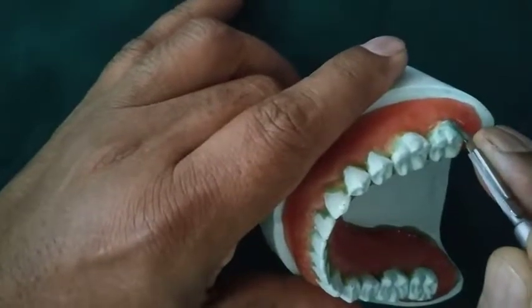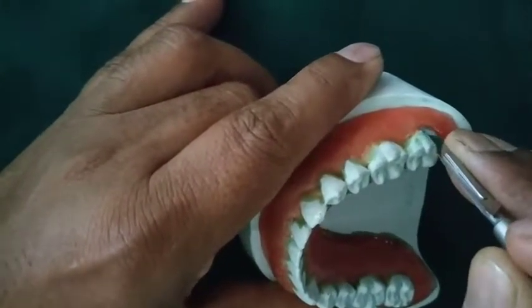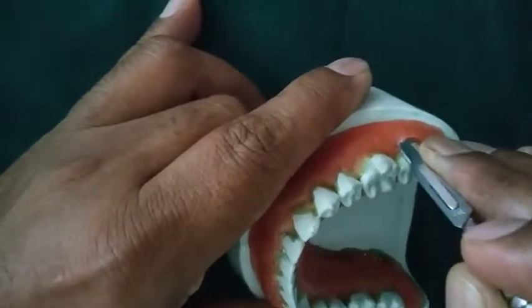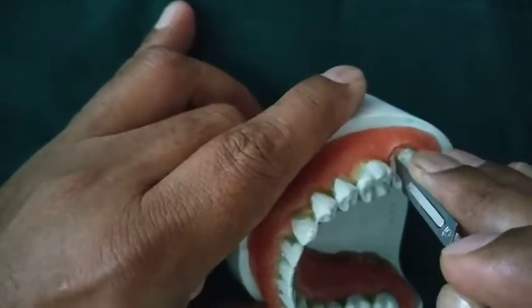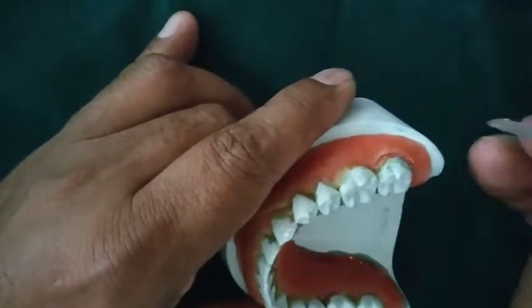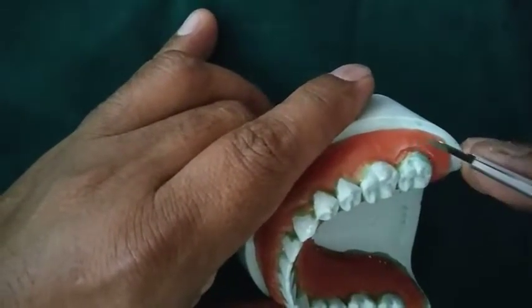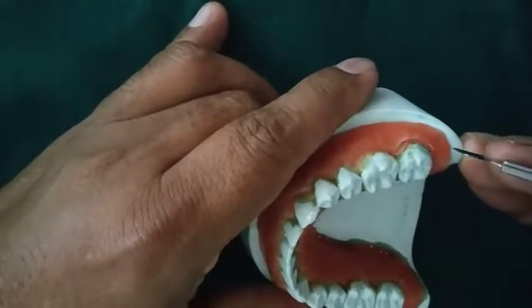And then we move mesially. This is the incision. You can appreciate that the marginal gingiva is now separated from the periodontal flap. This is the inner half of the periodontal flap, which is the diseased tissue.